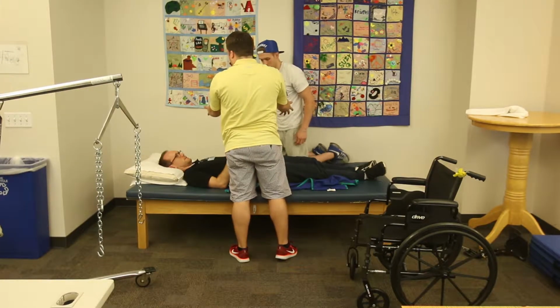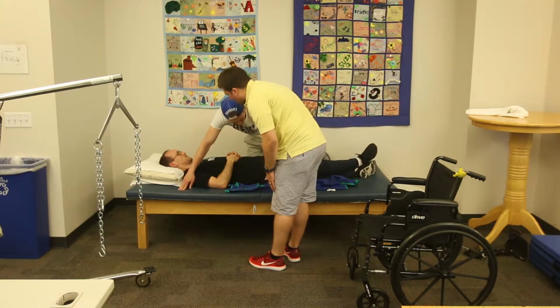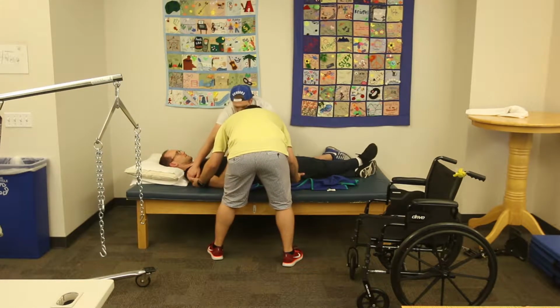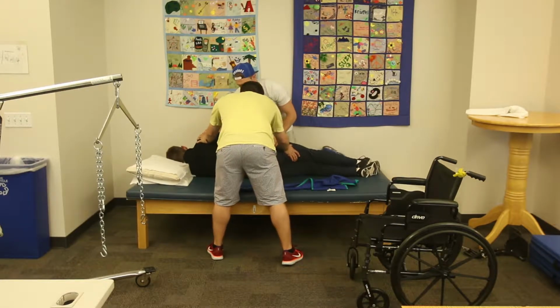So we're going to roll you towards Jared. Jared's going to put his hands, one right here underneath your hip, one underneath your shoulder, and I'll do the same. And on the count of three, we're going to roll you. All right? Okay. 1, 2, 3. Jared. Perfect.